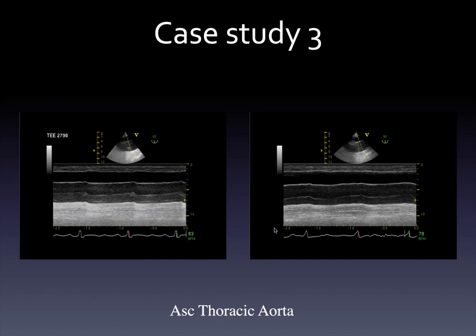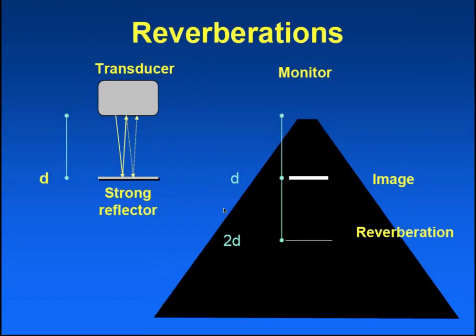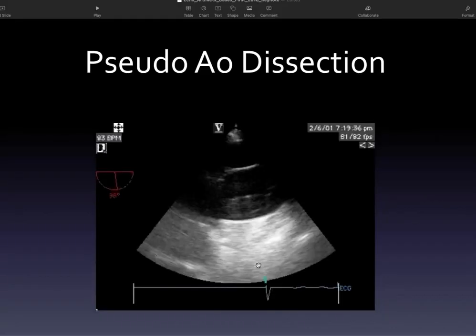I think you're thinking it's mirroring, so it's the same distance from the probe as well, so it's kind of reflecting distally. Exactly. Yeah, you got it. So the mirror artifact is very typical, in that it has a very similar distance. Let's see if this thing moves. Okay, so here you can see this distance and this distance are exactly the same.